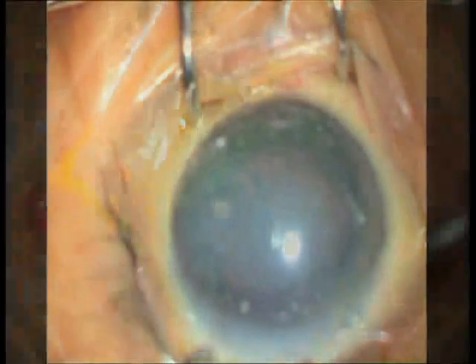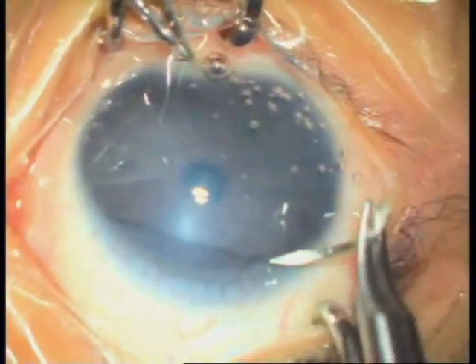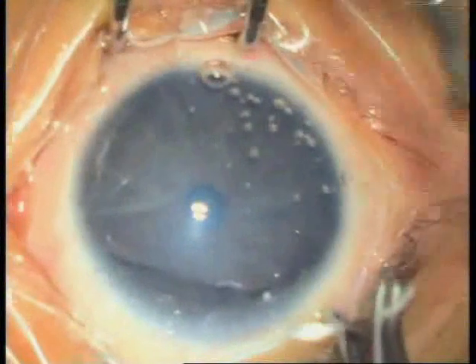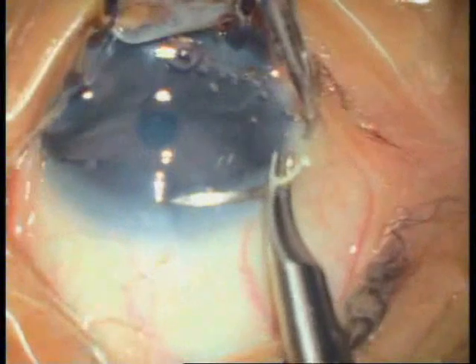This child presented with bilateral congenital glaucoma with corneal edema, more in the left eye than the right eye. The sclera is barely visible due to the buphthalmos. The globe is rotated downward with a corneal stay suture.